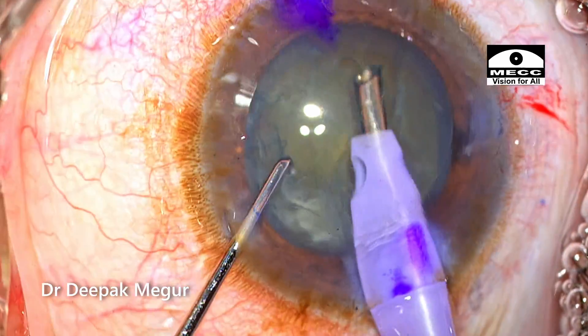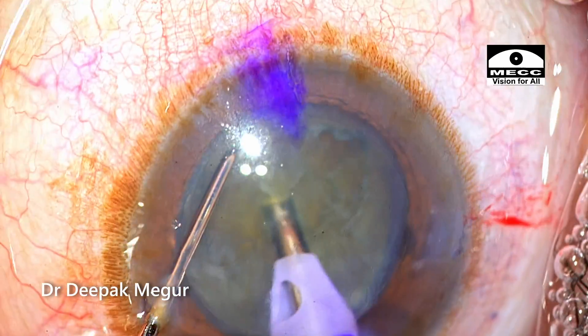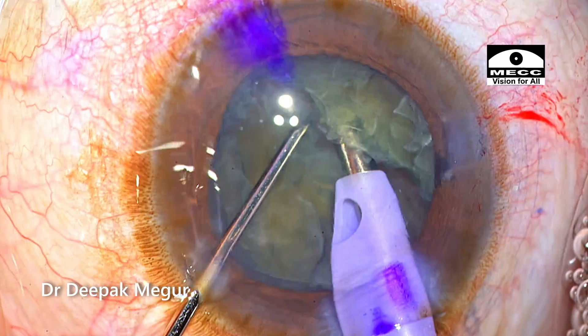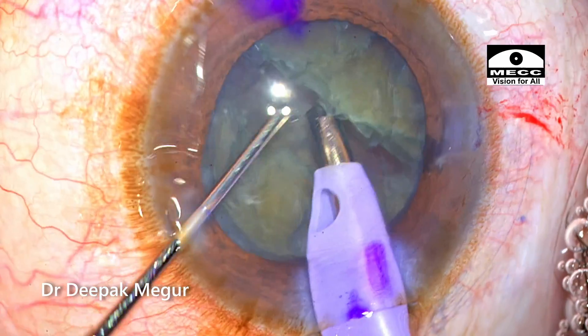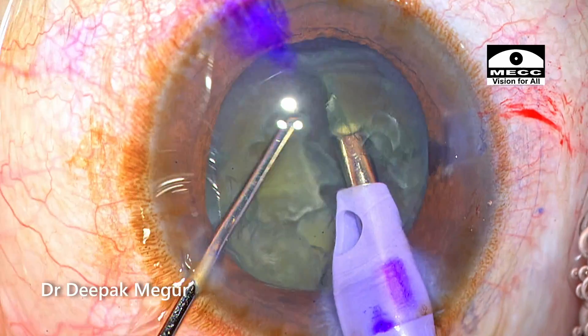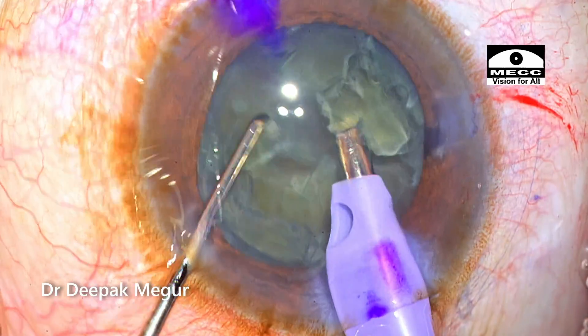As I begin the nucleus management, the initial epinucleus is being aspirated now. At this stage I'm still not able to notice any Descemet's membrane detachment at the side port. The nucleus division process is being done in the routine fashion — it's not a dense nucleus, and it's divided easily into smaller fragments using the vertical chop technique.